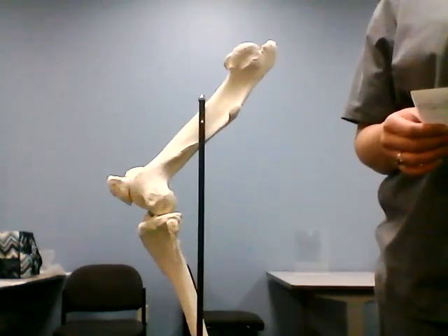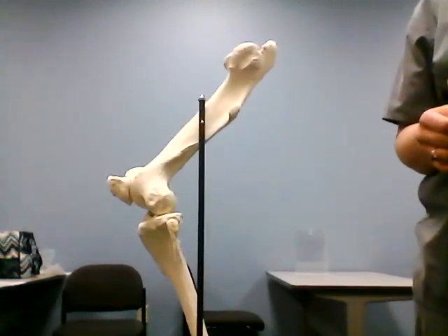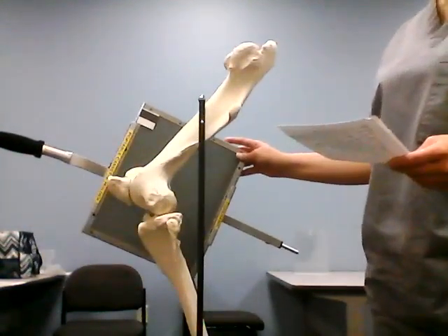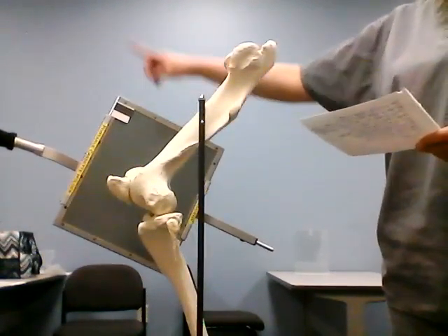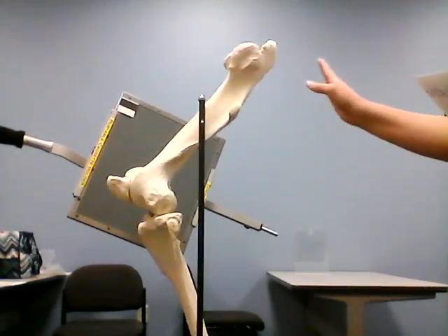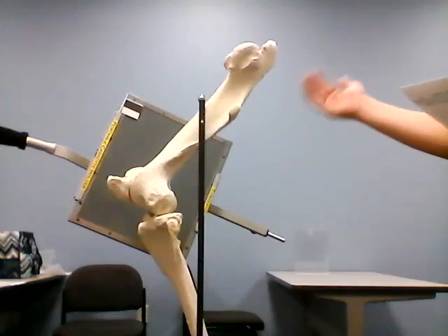You will need to place the horse in a natural standing position. Put the cassette at an angle, and the label should be cranial dorsal. Cautiously place the cassette on the medial side of the stifle joint.